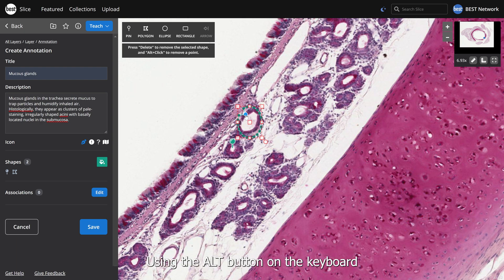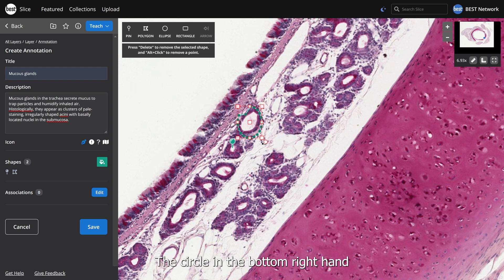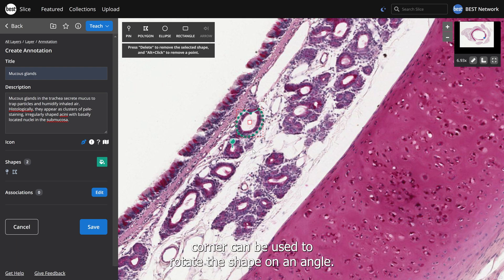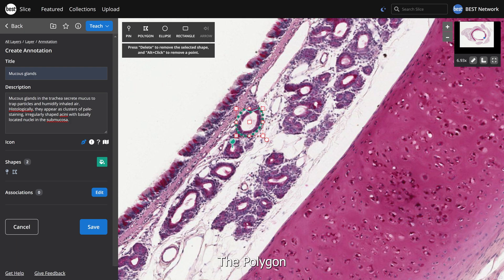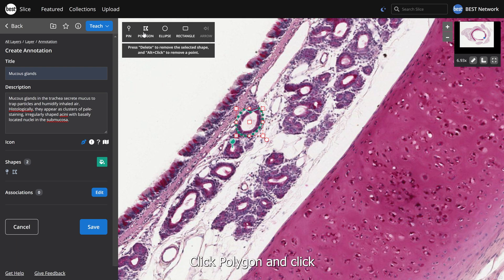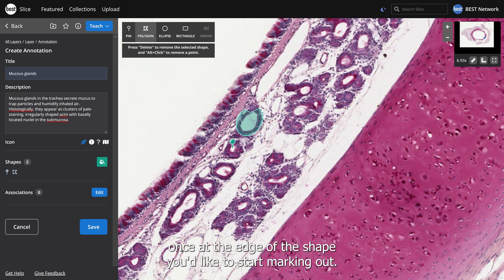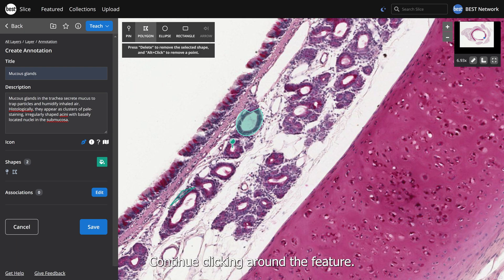Individual points can be moved by dragging them to a new location. Using the Alt button on the keyboard while clicking can remove a point. The circle in the bottom right-hand corner can be used to rotate the shape on an angle. The polygon tool is perfect for more complex features — click Polygon and click once at the edge of the shape you'd like to start marking out, continue clicking around the feature, then double-click to finish.